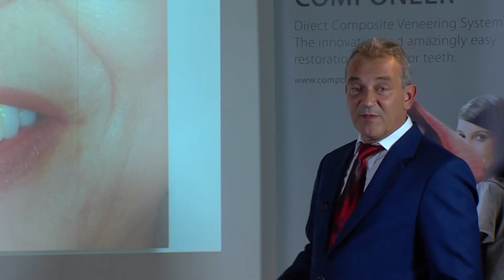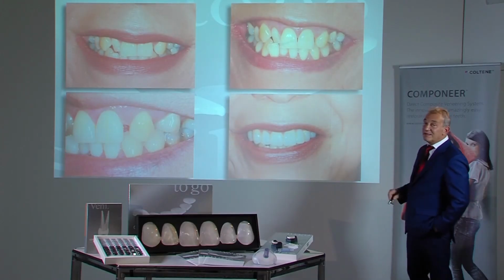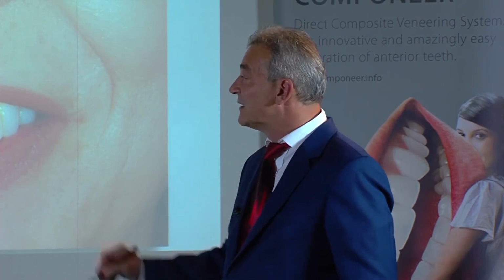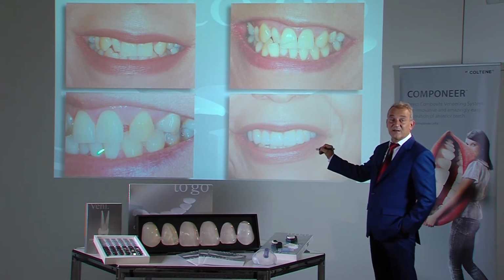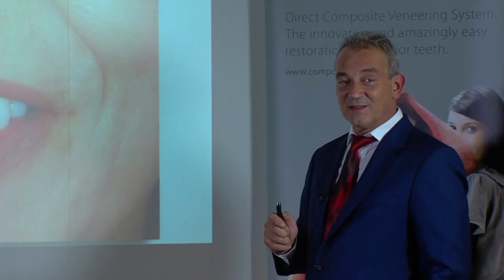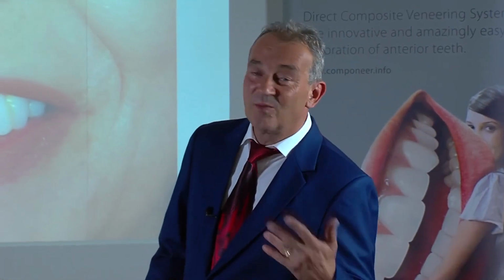This is a problem we can solve. We know that we can shift forwards. The question is, how do we achieve symmetry in this region? Because the teeth cannot be corrected forwards or backwards. If we make the tooth wider, the 3 would be too wide, and the proportions would no longer be correct. If one looks at the final photo, then one can see 3, 2, 1, 1, 2, 3. Where there were 5 teeth, we now have 6. In principle, this can only be achieved with composite.